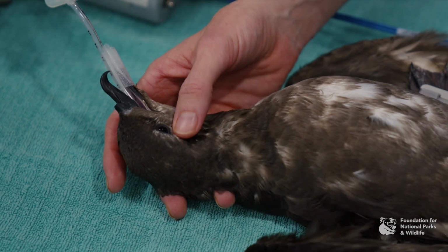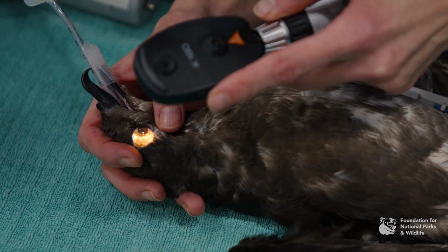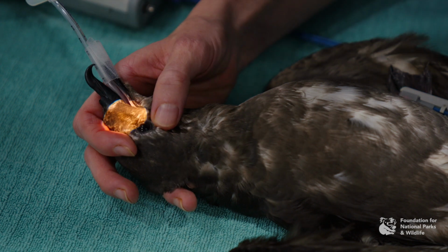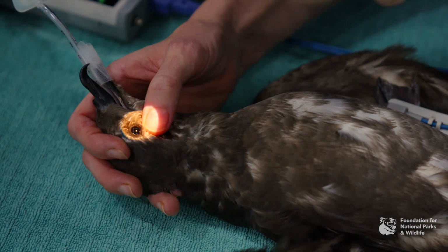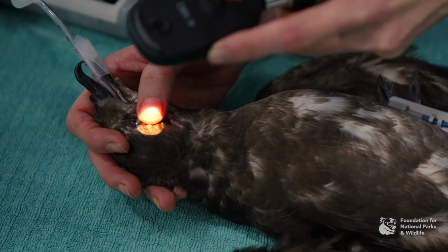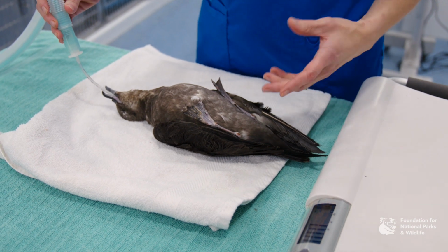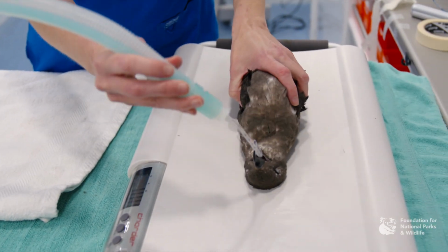While the bird's under anaesthetic, this is a good opportunity to do your ocular exam. So you want to look at the iris, look at the lens, and then go to the posterior chamber and have a look to see whether the pecten is intact or not, and if there's any discharge or anything stuck in there. So while your bird is under anaesthetic, this is a good time to weigh it because you're going to get a nice, correct weight of the bird.